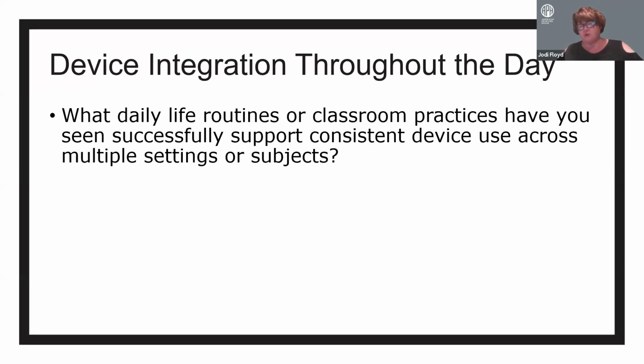And then as far as classroom practices, the biggest buy-in is having the teacher politely remind the student or offer the student the option of using a device, but not browbeating the student into using the device. It's one of those things where you have a teacher who just quietly steps beside the student and says, do you think this might be something that you want to use your magnifier for? Or is this something you might want to use your Visio Lux or your Jupiter for? But not browbeating the student from the front of the room.